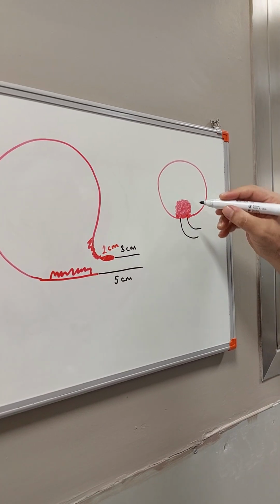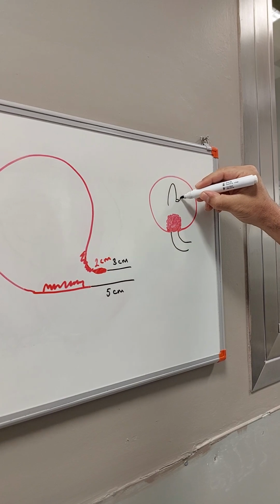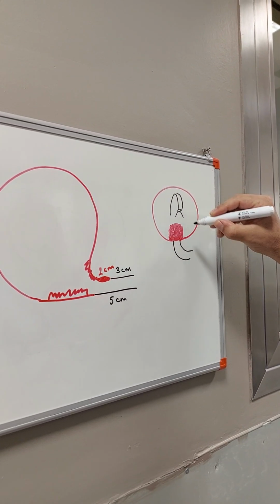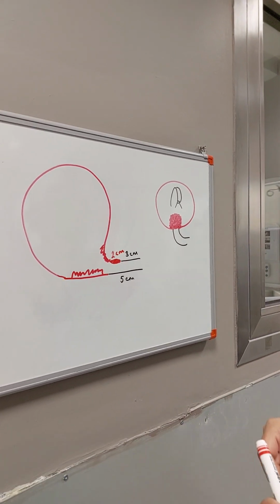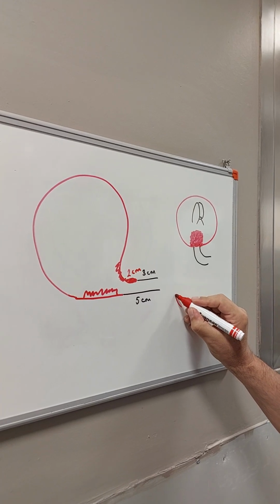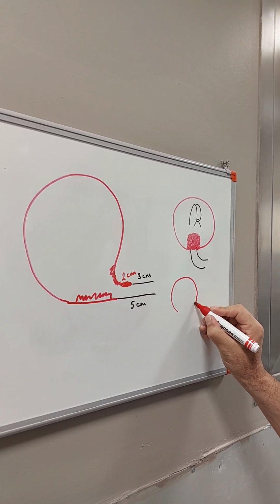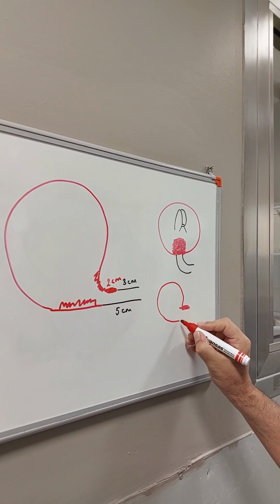We are inside with the flexible instrument, looking upside down. Okay, and then when we go with the rigid one, we know that some part of the bladder is moving into the urethra.